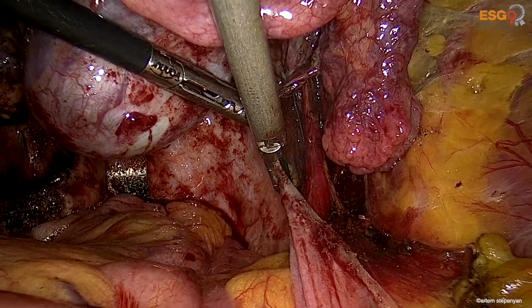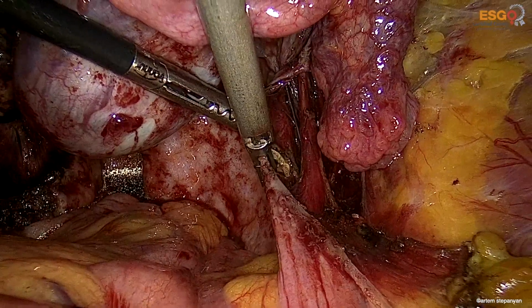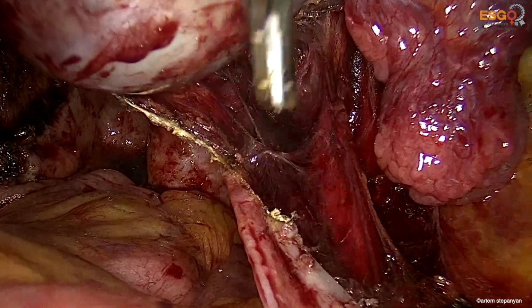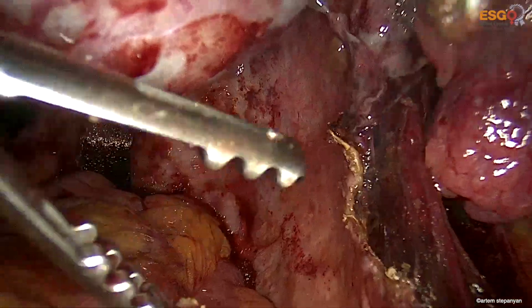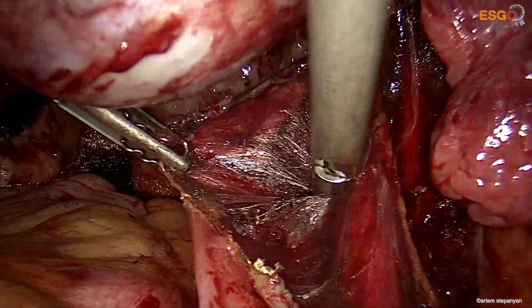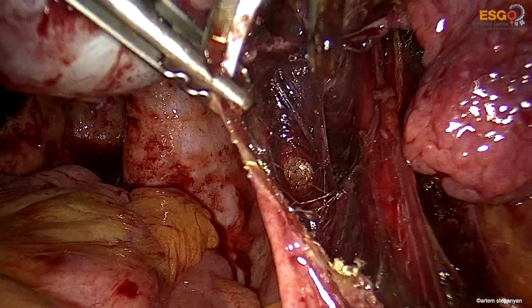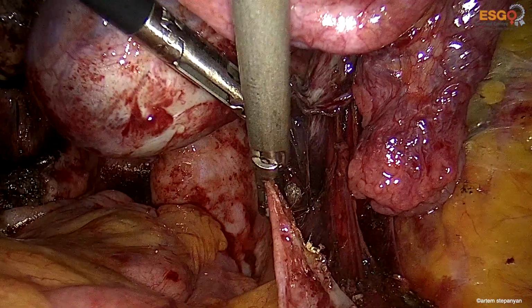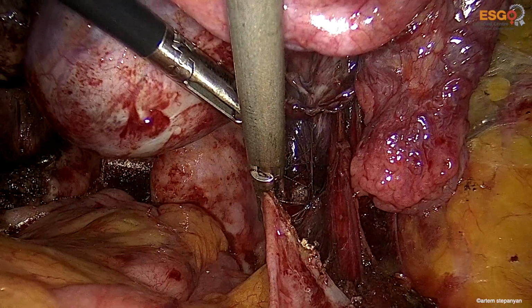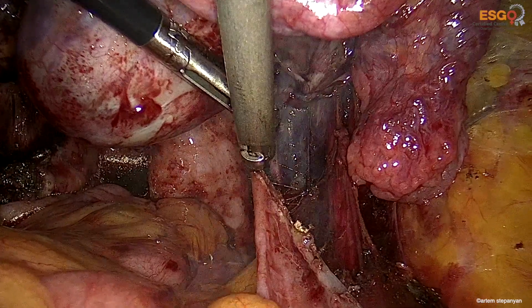Here we demarcate, I would say we cut in size the pelvic peritoneum, or so-called posterior leaf of the broad ligament of the uterus, again alongside the mesorectal fascia and mesorectum, which is preserved.